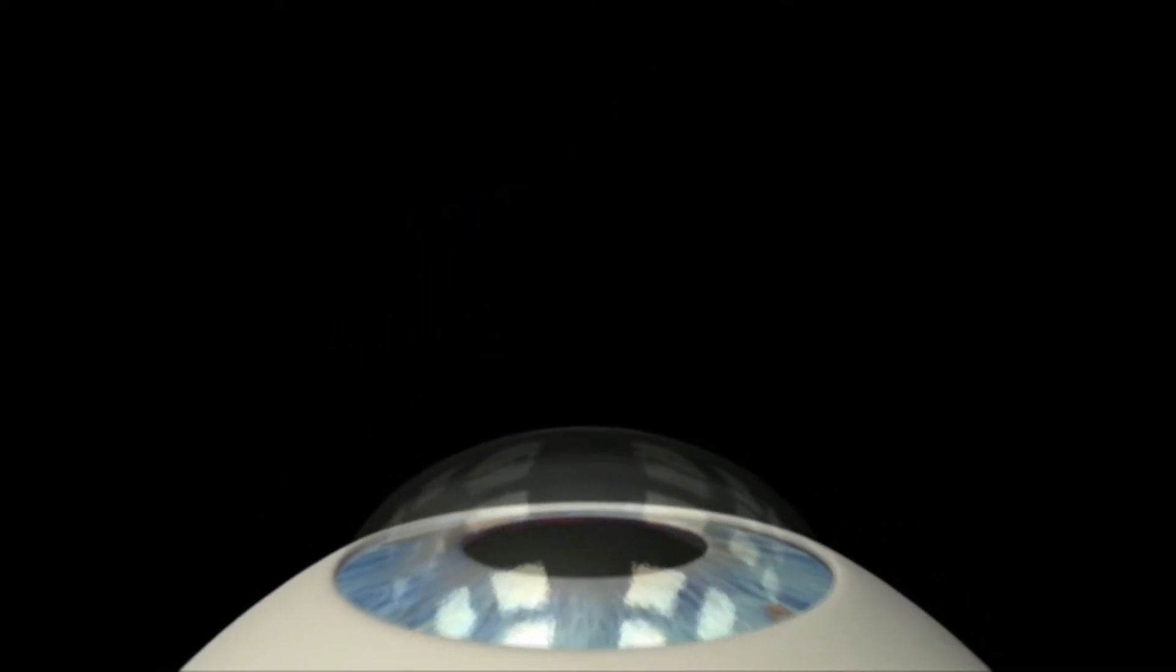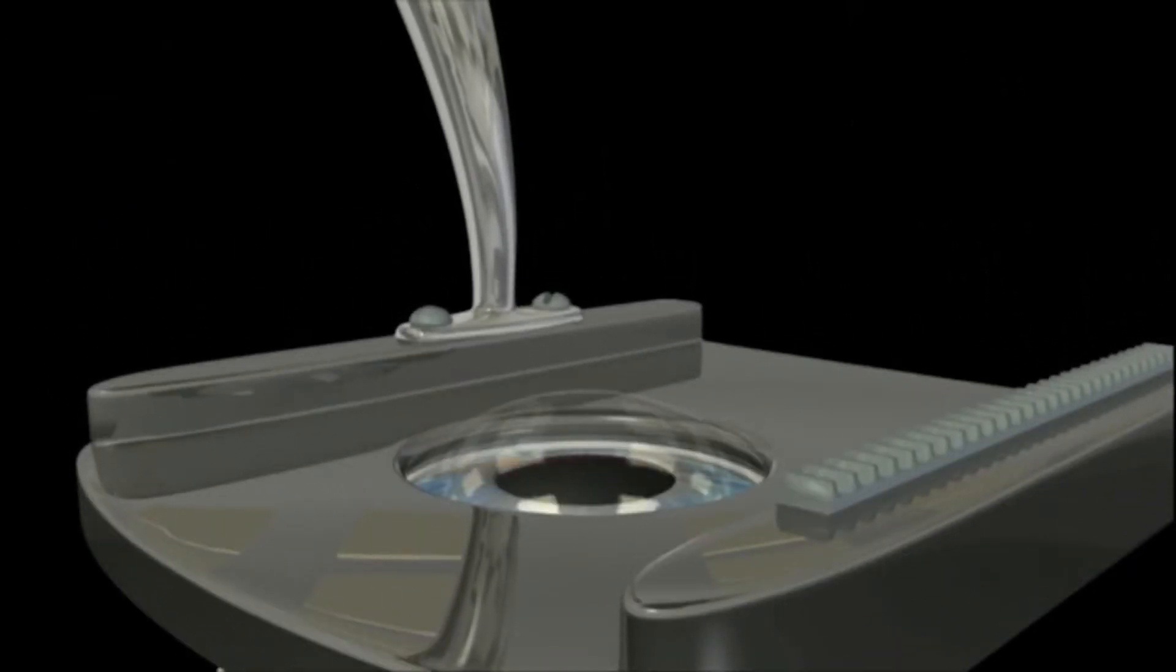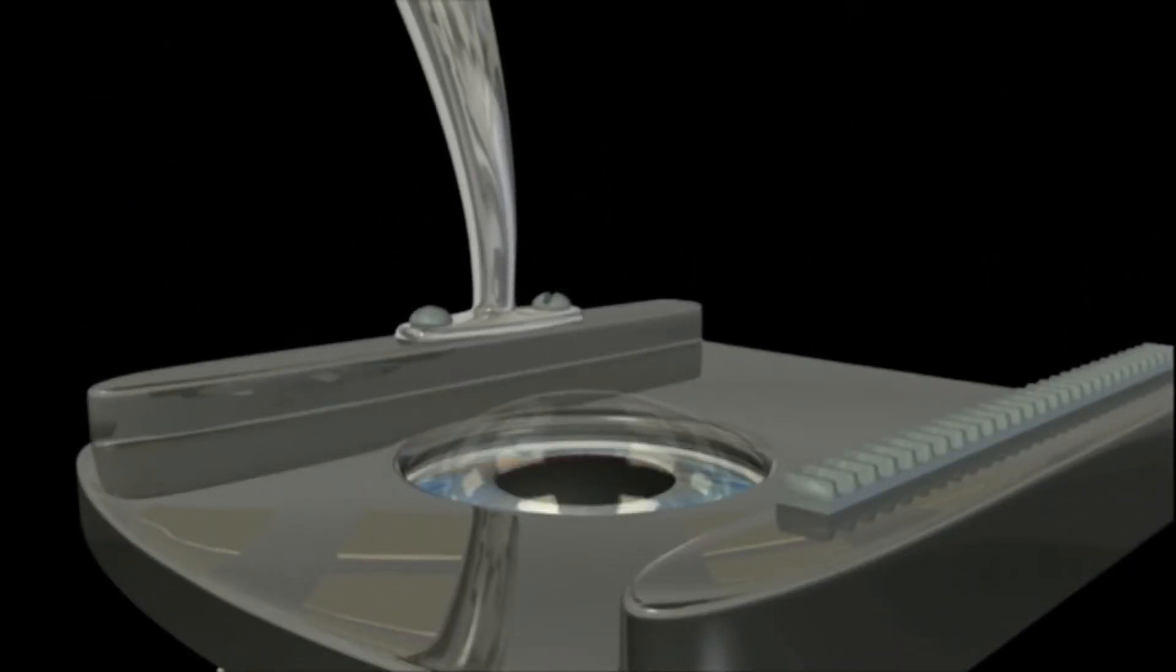The process begins with your doctor using eye drops to numb your eye. Next, a suction tool is placed on your eye to give stability to your cornea. A slight squeezing sensation may be felt at this point.